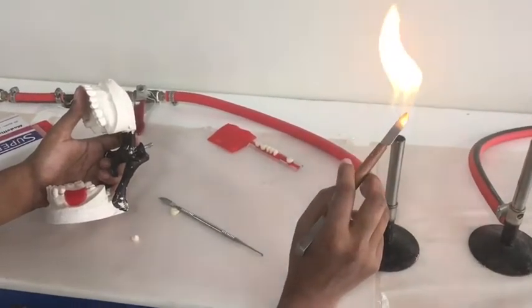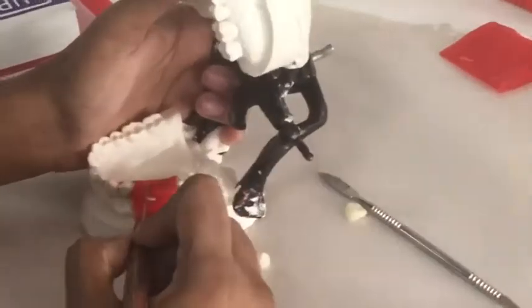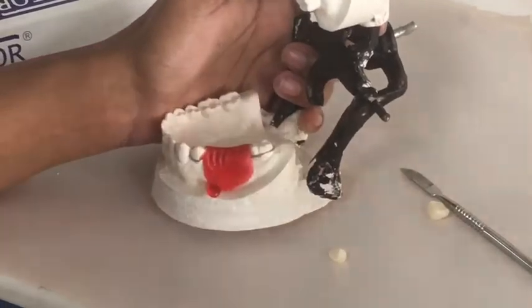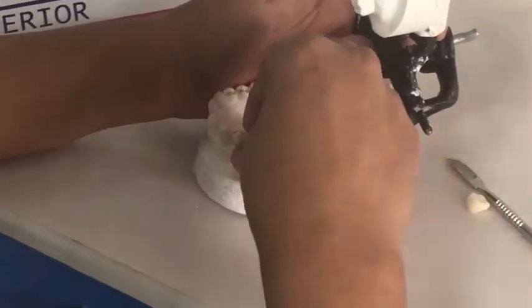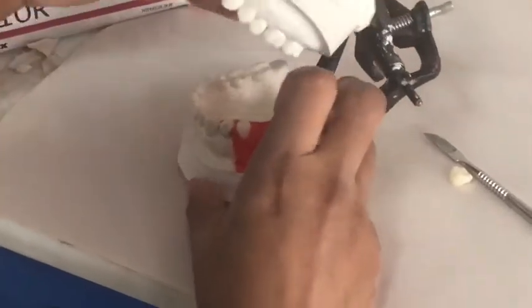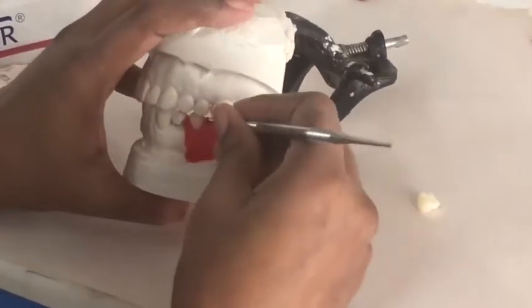If you draw a line in the center of the wax ridge connecting the central occlusal groove of the first premolar and the second molar, your teeth should be positioned buccolingually in such a way that the occlusal groove of the artificial teeth coincides with that of the adjacent teeth. Similarly, you should also consider how your teeth occlude with the opposing arch on the model.